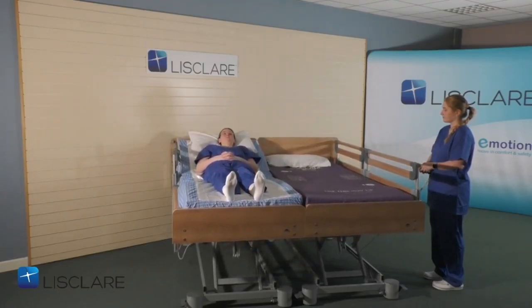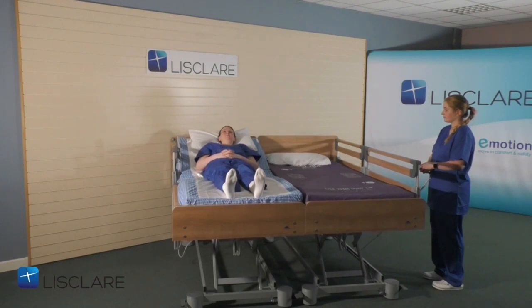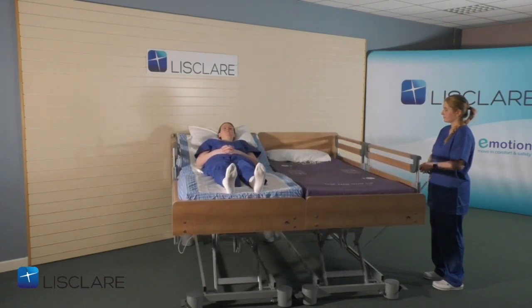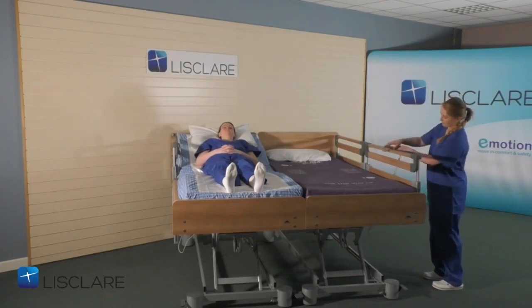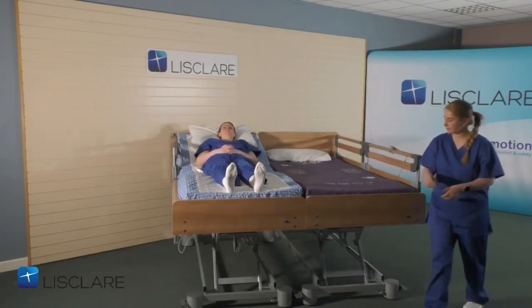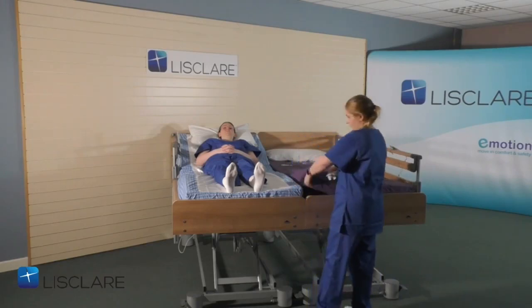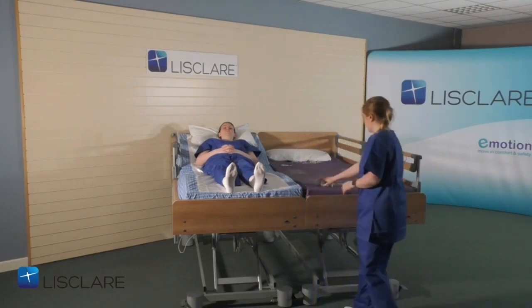So that's Cara bringing it up to full working height. Now, there is a safety clamp in the centre of the bed, which you'll see Cara removing now at the end, just to be sure, because the bed has central brakes, but it doesn't move. As you can see, there's quite a lot that's leaning on it. So that's the actual safety clip removed.